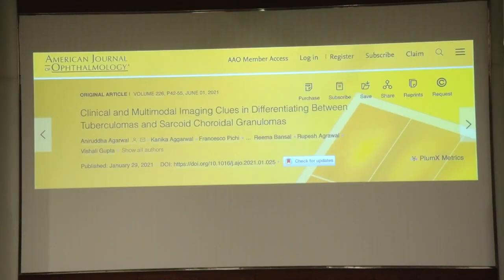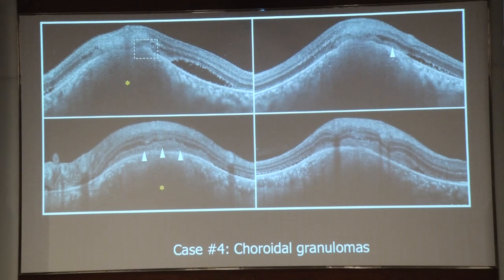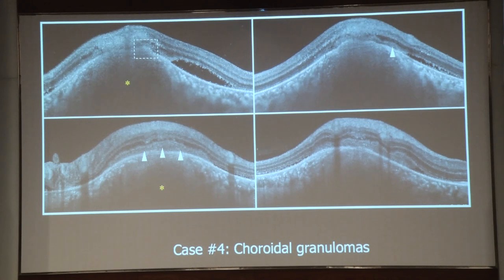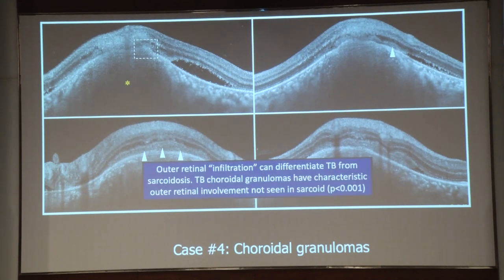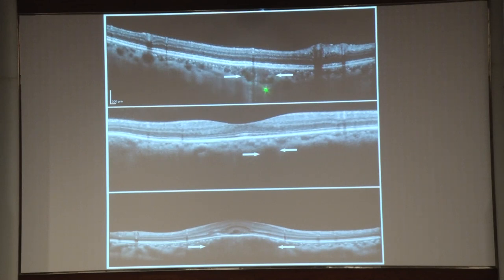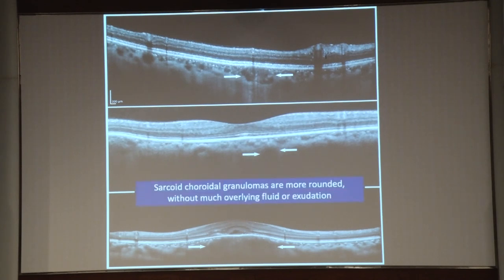The last case is based on a publication differentiating TB and sarcoid granulomas. If you have a very large choroidal granuloma, you can image it using OCT. When you have outer retinal fuzziness or infiltration with subretinal fluid, it is definitely going in favor of TB and not sarcoid. On the other hand, if you have well-circumscribed choroidal granulomas without much subretinal fluid or outer retinal infiltration, it goes in favor of sarcoidosis. Of course, you have to look at systemic investigations like chest CT, IGRA, and other tests. With this, I'd like to end — if there are any questions, we can take them at the end. Thank you.